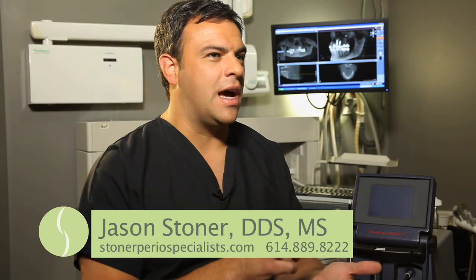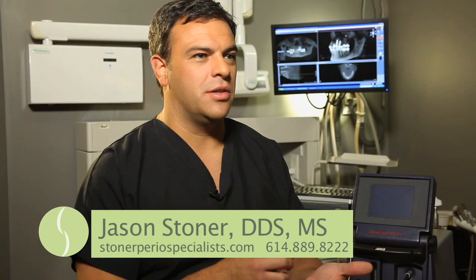If I were using a diode or a CO2 laser, it would just burn the paper. But this is very specific because it targets inflammation and pigment, unlike the other two lasers. That's why we don't use those other lasers in periodontal therapy, which can actually damage the gum and bone. So we can remove that safely and non-surgically for the patient, which is more comfortable.